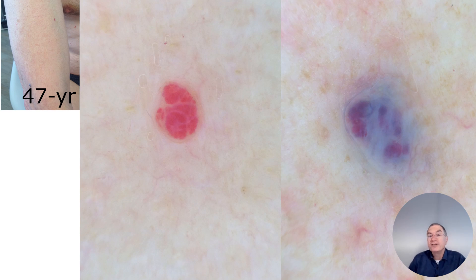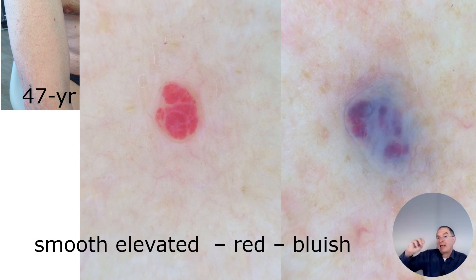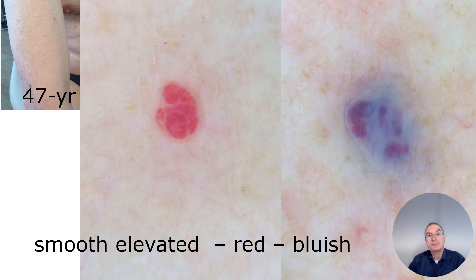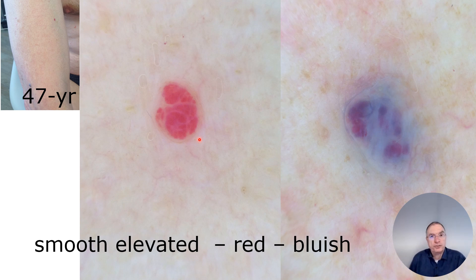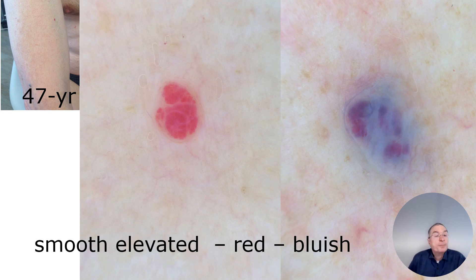We know these lesions — they are smooth and a little bit elevated on palpation. We know them also from their different colors. The colors depend on the location of the angioma. Here in the middle on the left hand side we see a clear, very fresh red, meaning it is just underneath the basal membrane with a lot of oxygen. On the right hand side it is a little bit more bluish, meaning deeper in the dermis and perhaps less oxygen. So depending on the color we can tell where the angioma is located.